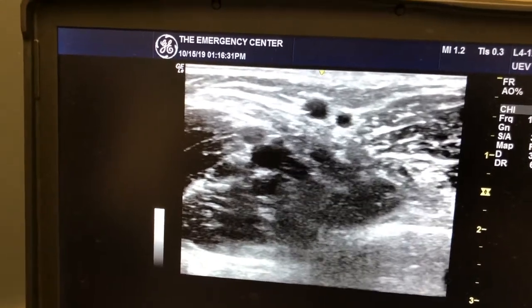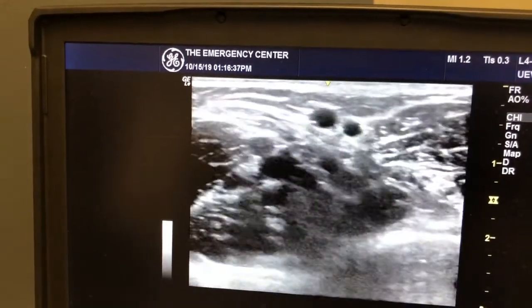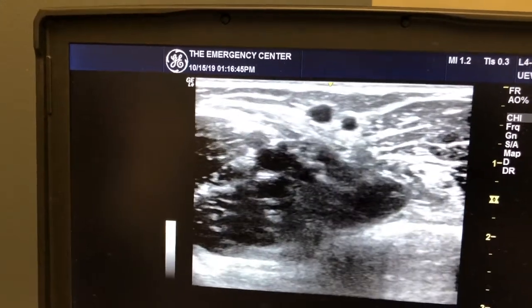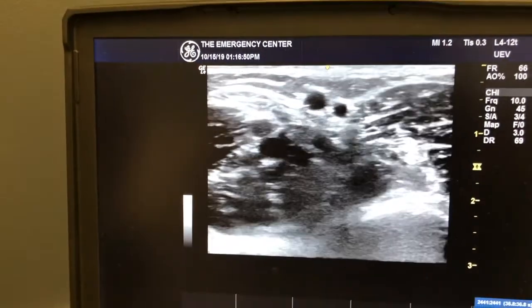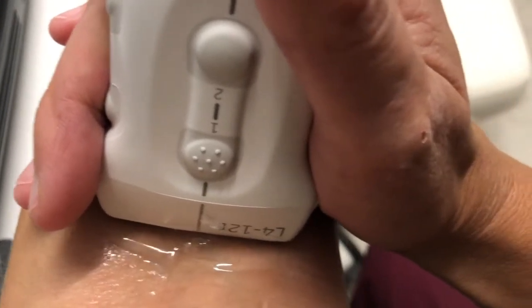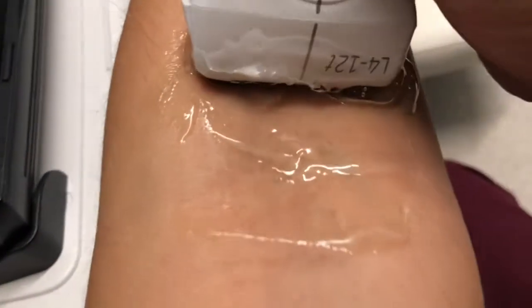And you can confirm that it's a vein because as I press, I'm compressing that vein completely, where an artery is not going to compress, right? So that's just one way for you to confirm that that's a vein versus an artery, okay? And just remember that whenever you are holding this probe onto your patient's arm, you have a very light touch in order to not compress that vein, so you can see it. And there's the central marker, that line. Well, actually what you're gonna look for is that.